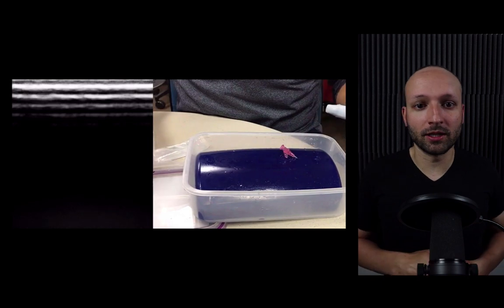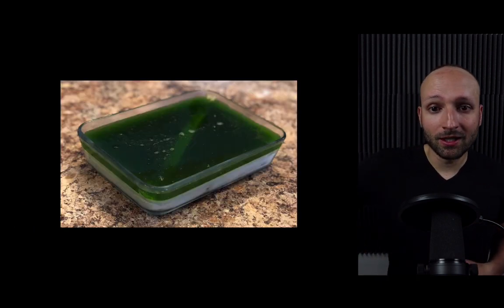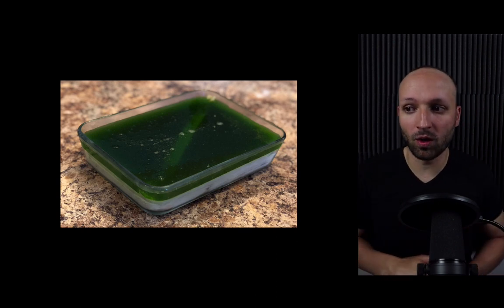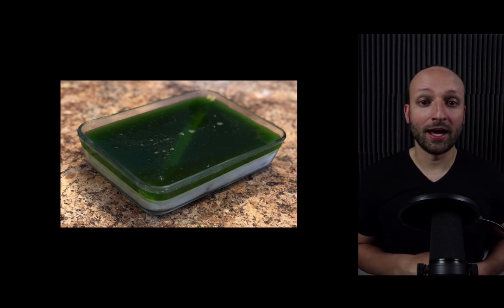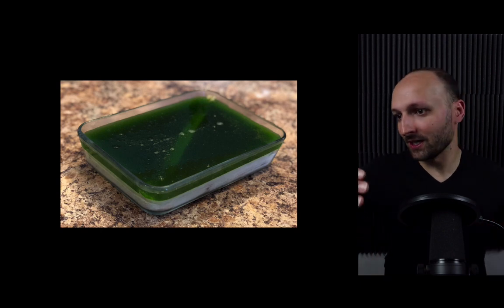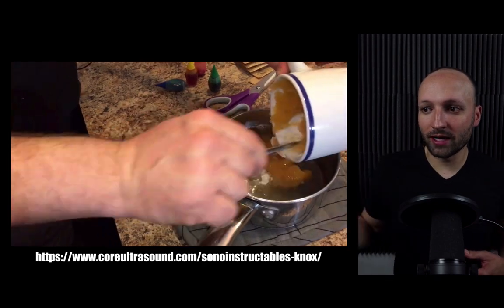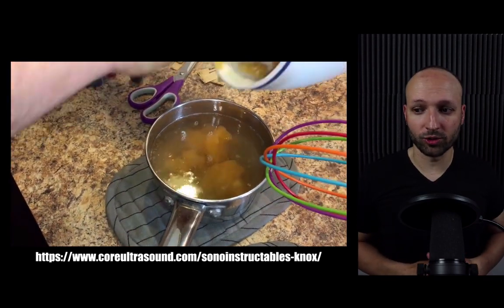Here is me doing an ultrasound guided IV on a Blue Phantom simulator. You can create these at home. This is one made out of Knox gel that Jason Bowman, who's one of my former residents, and I made. We didn't invent this technique. This is just one that we made. And Jason and I actually created a bunch of tutorials on the Core Ultrasound website.